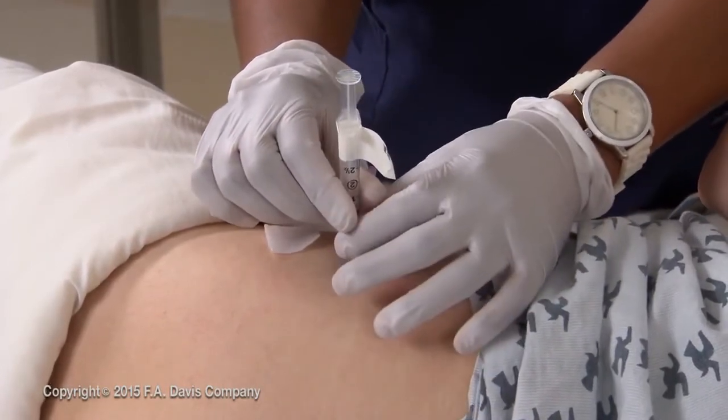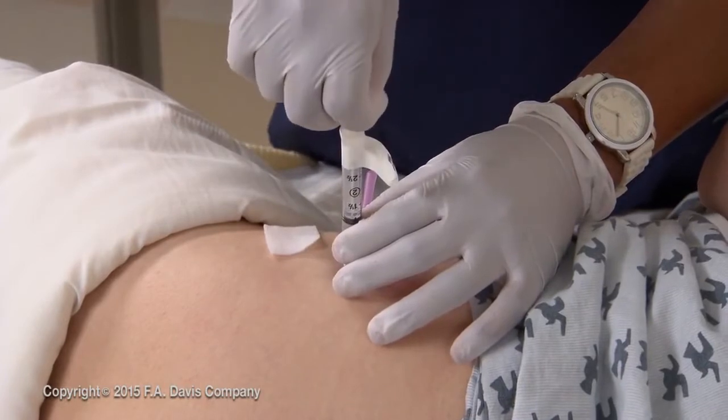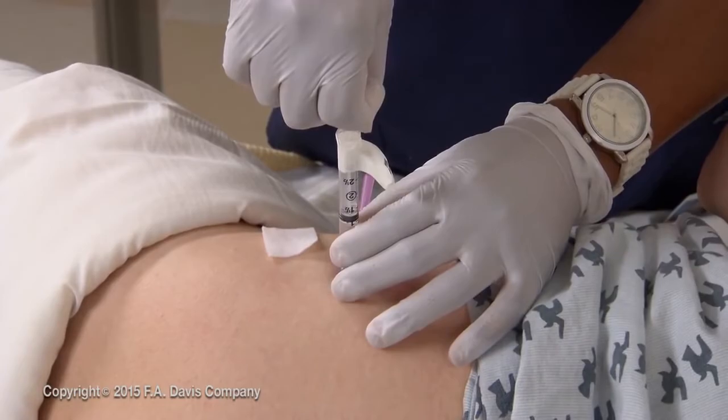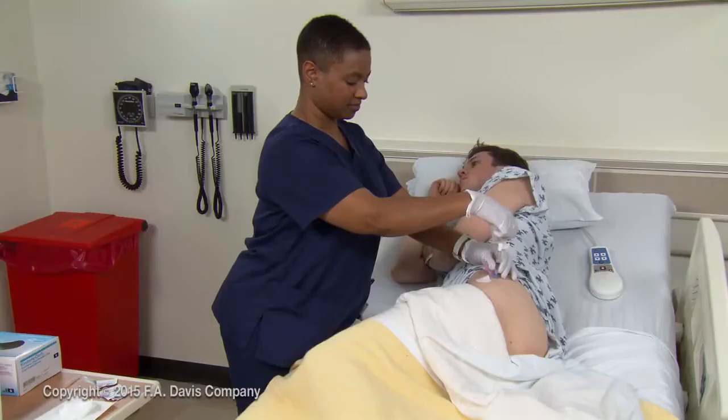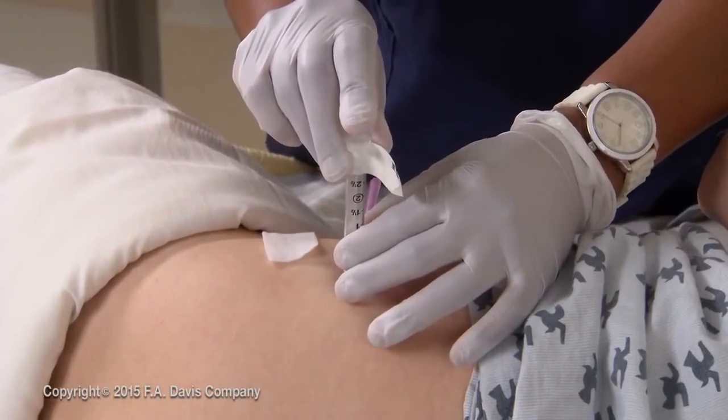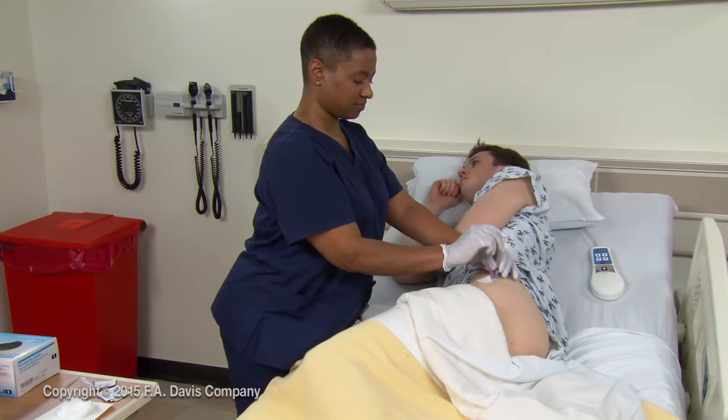Stabilize the syringe with your non-dominant hand. As a rule, aspirate by pulling back on the plunger and waiting for 5 to 10 seconds. If there is no blood return, continue with the procedure. Using the thumb or index finger of your dominant hand, press the plunger slowly to inject the medication.